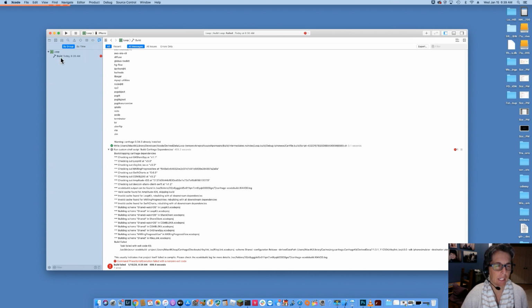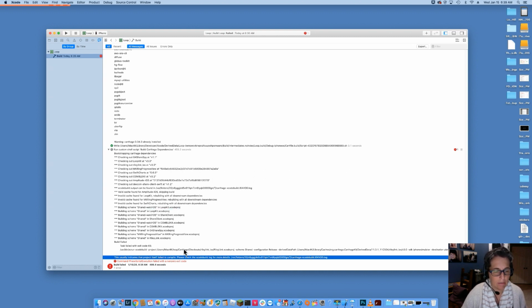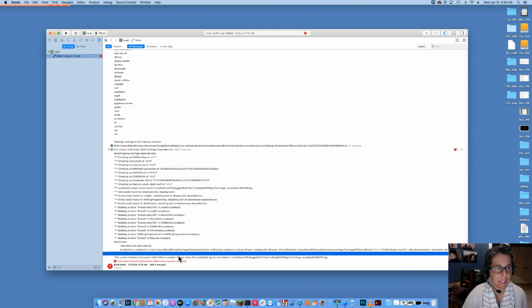I click on it, and then this line here that says build, you might have several of them if you've built several times. Take the top one and click on that, and that will give you a little bit more detailed information than just general cart file error. And I can see it basically failed on building Riley Link with an exit code 65. So let's see what that is and see if we can find a quick solution.